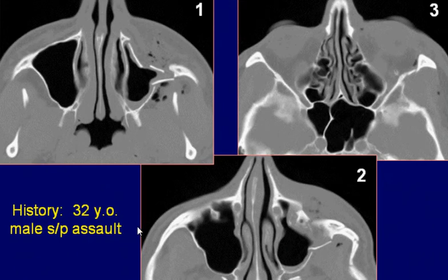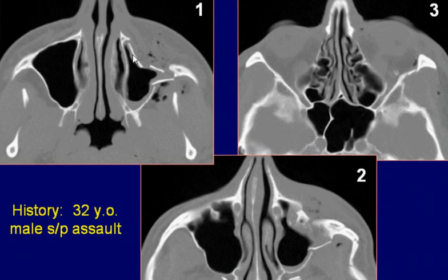A 32-year-old male with history of assault. Axial CT images of the face in bone window settings demonstrate comminuted fractures with depression deformity of the anterior and lateral walls of the left maxillary antrum.